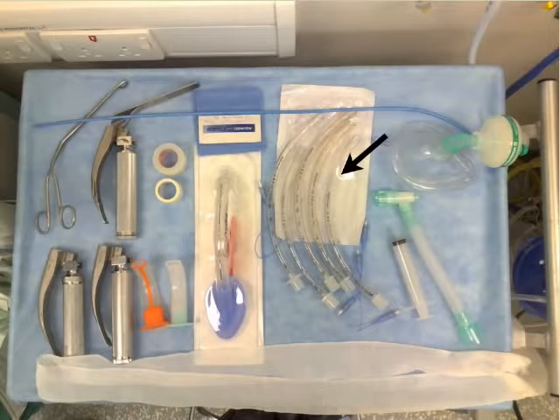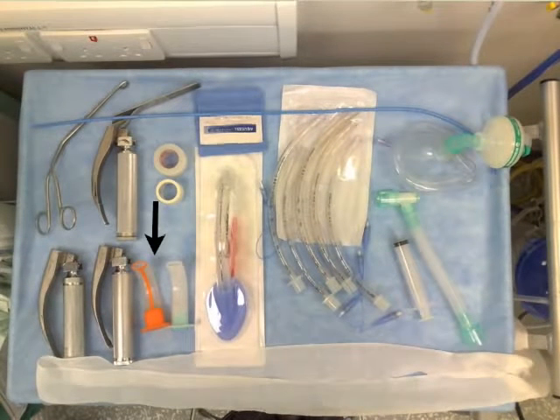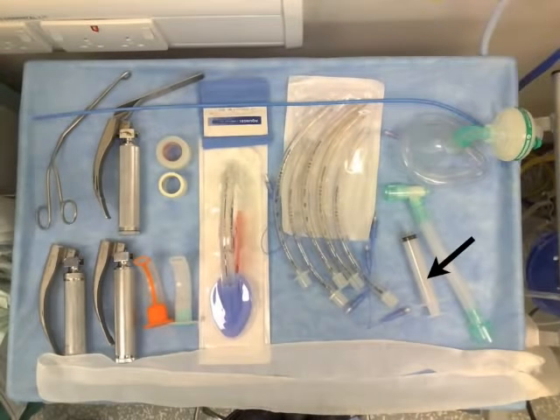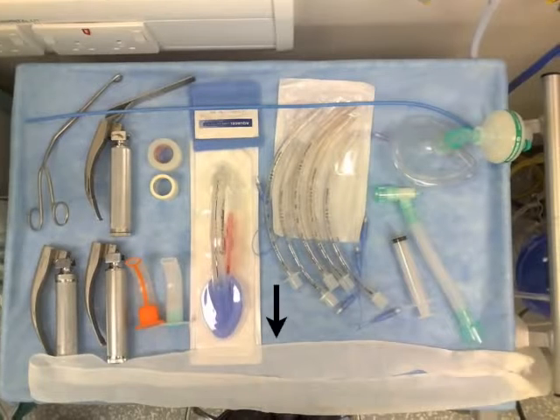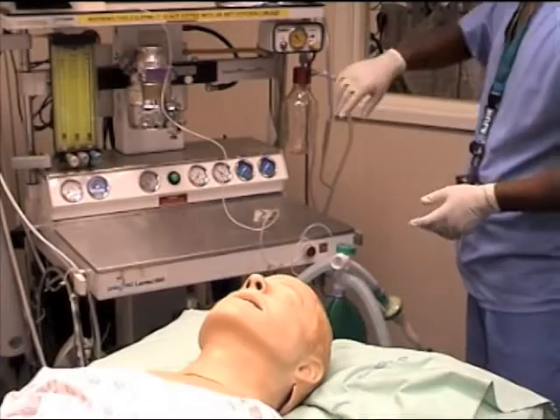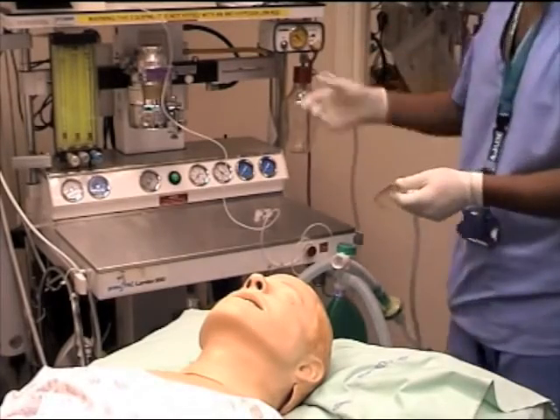sizes of endotracheal tubes, laryngeal mask airway, oropharyngeal airway, mask with a filter, catheter mount, syringe for inflating the cuff of an endotracheal tube, gel and swabs, McGill's forceps, bougie, and a tape or tie to secure the endotracheal tube. Apart from these instruments, a means of ventilation should be available and checked. Suction must be on and the suction catheter kept close to the patient.